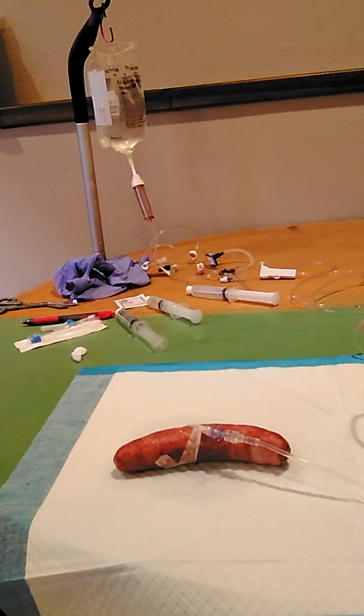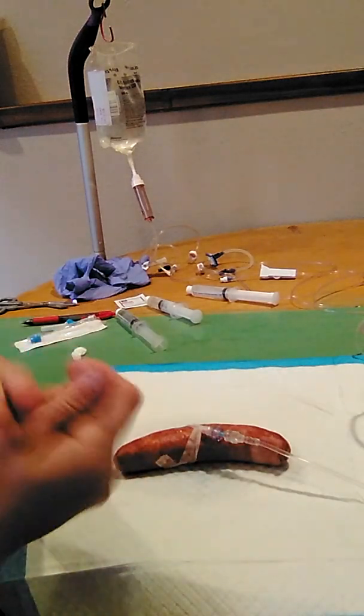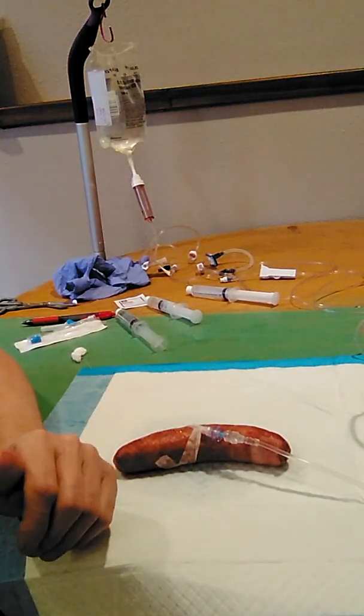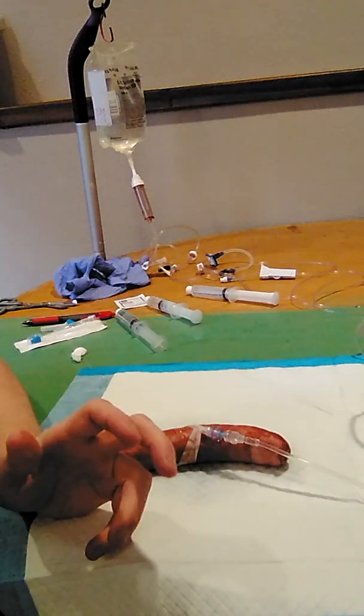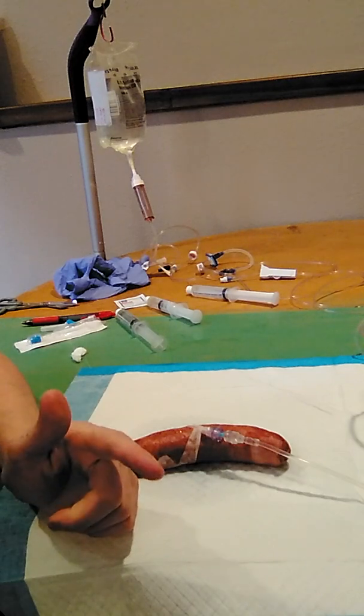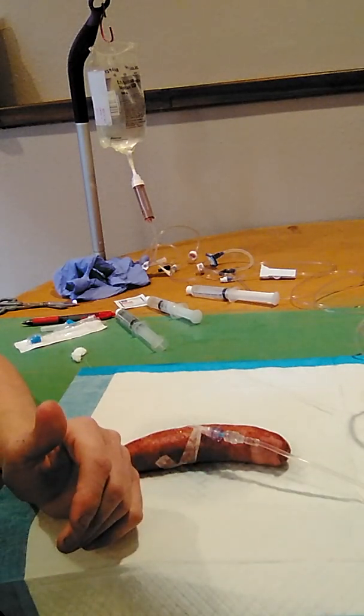This video is for the IV change of a continuous IV to a lock. The first thing I would do is approach the patient, perform my hand hygiene, identify the patient with two means of identification, and then check my 6 rights of medication administration, being the correct documentation, the correct route, correct patient, correct time, correct medication, and the correct dose.